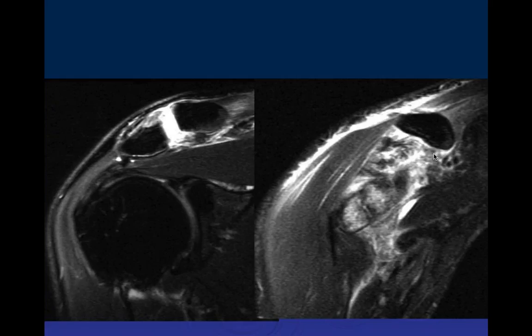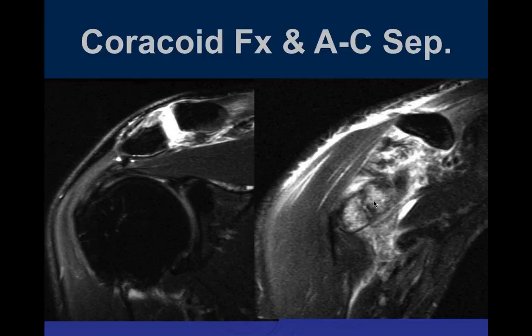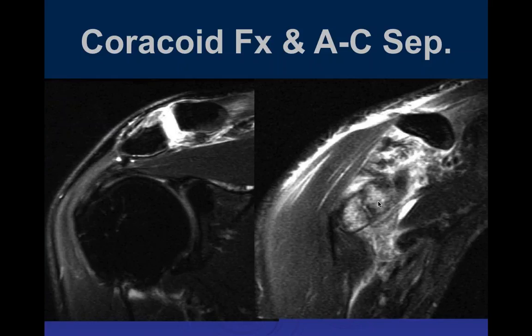You can see a fracture here with fluid on the other side — a coracoid fracture with AC separation. The bone shows edema and a fracture line; the other bones are dark as expected with the fat-suppressed sequence. The CC ligament was also injured in this patient, but in addition there was a fracture of the coracoid process.